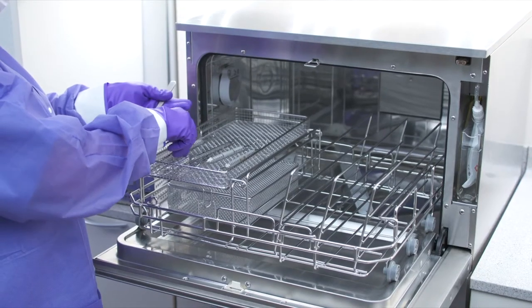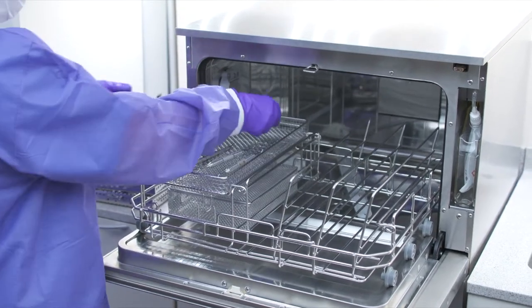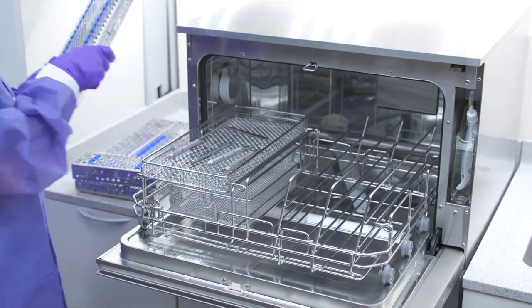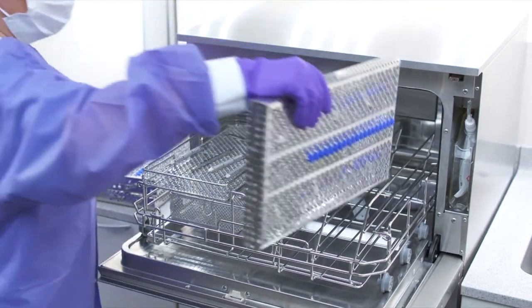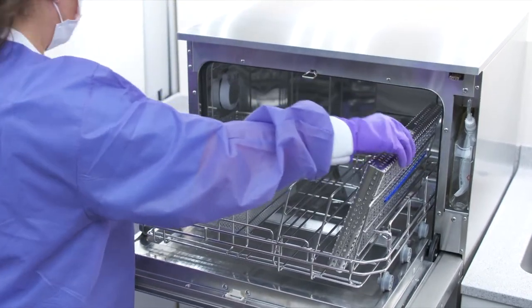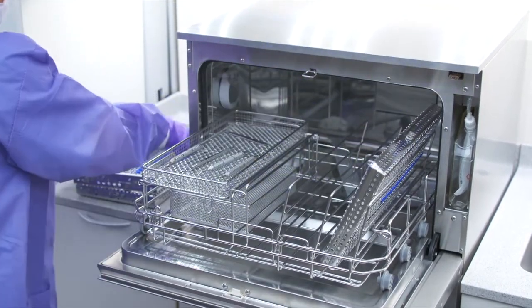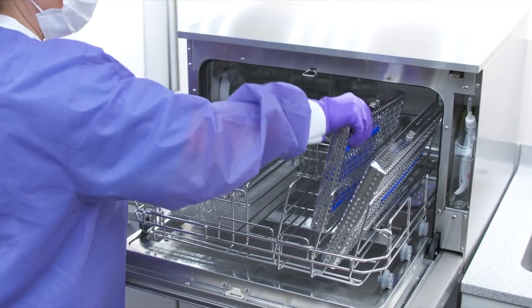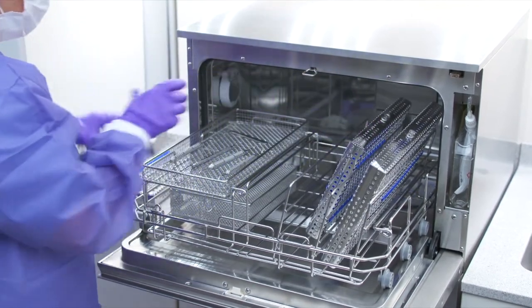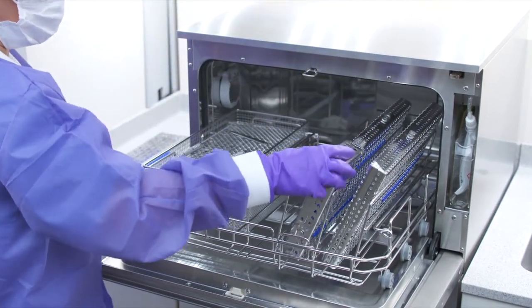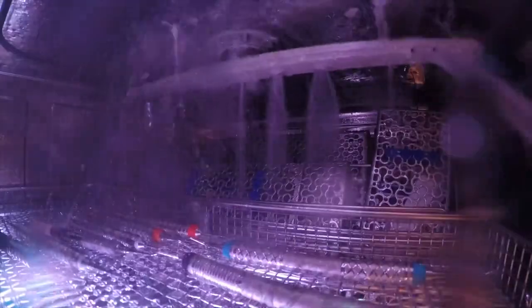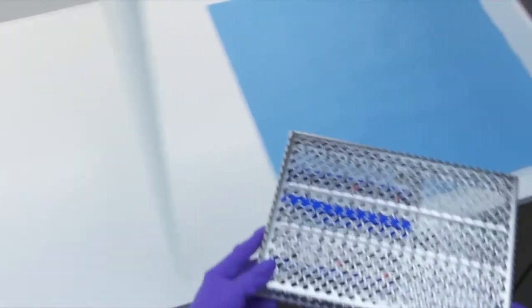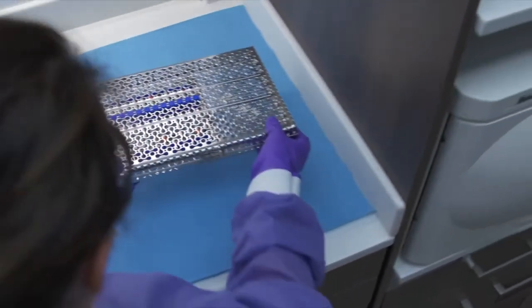The Hydrum C61 instrument washer is a clinical reprocessing device that minimizes physical handling of contaminated instruments, reducing the risk of sharps injury and creating a safer work environment. Every set of instruments receives the same validated cleaning process with each cycle by dosing the correct amount of detergent. This allows instruments to immediately be transferred to the next step of instrument reprocessing sterilization.